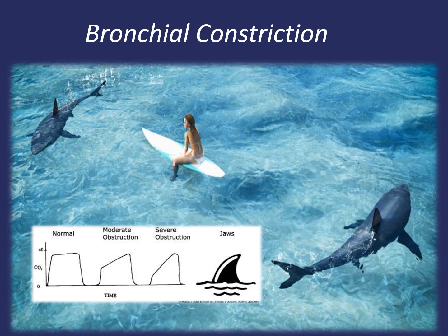During the bronchospasm, there is prolonged exhalation, so think of causes of bronchospasm or obstructive airway diseases. This could be asthma, COPD, chronic bronchitis, emphysema, or partial airway obstruction. These are all pathologies with extended exhalation phases, and this extended expiratory time leads to the blending of phase 2 and 3 until they are hidden within each other on the capnograph. The more phase 2 and 3 slur together, or the steeper the slope, the more severe the constriction.